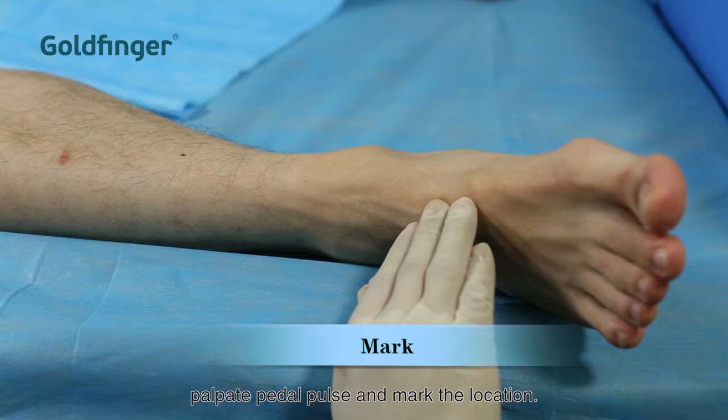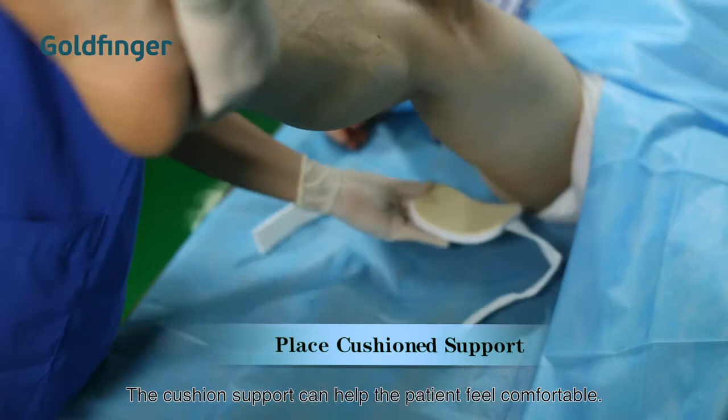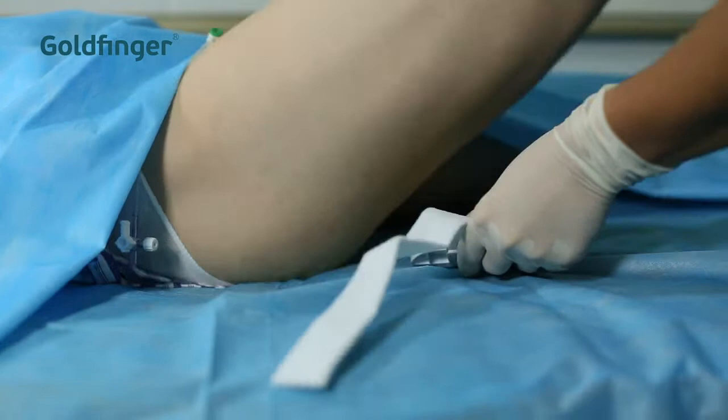Palpate the pedal pulse and mark the location. The cushion support can help the patient feel more comfortable. Place it under the thigh. The ideal position of the support should be near the hip.